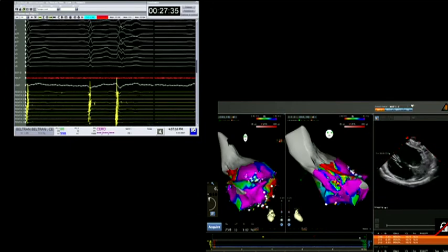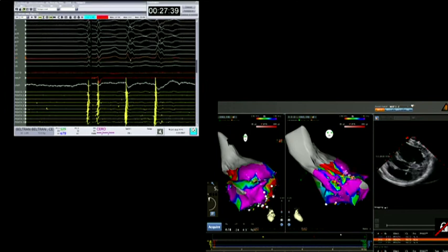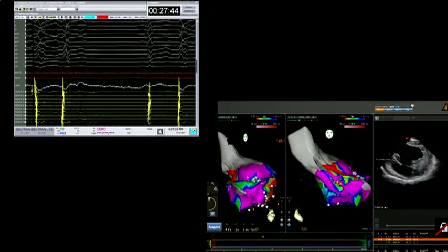Show me left. Okay, perfecto. Todo sobre la papilar anterior está ahora. Papilar anterior, como vemos, you can see that I'm on top of the anterolateral papillary muscle.